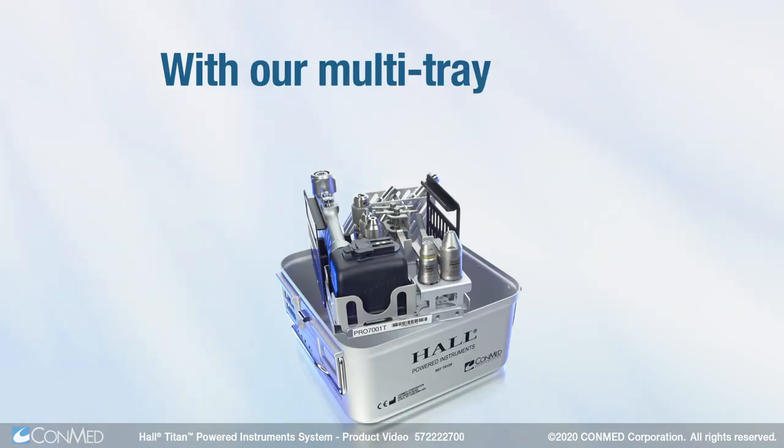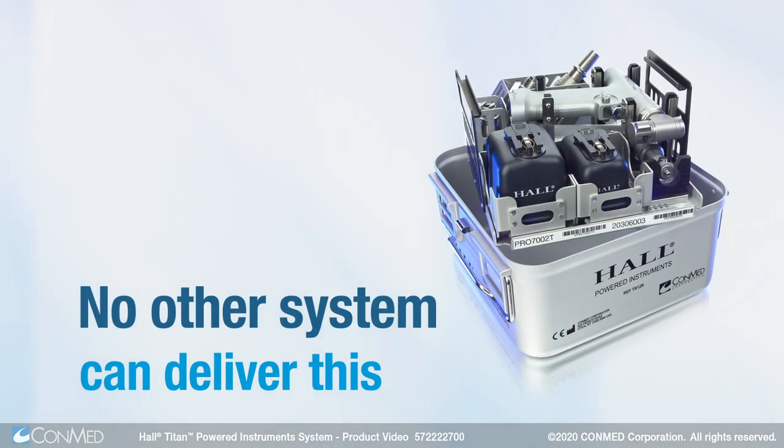With our multi-tray system, sterilize only what you use. No other system can deliver this.